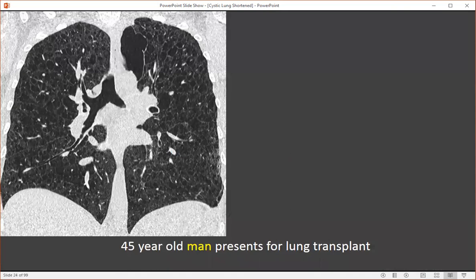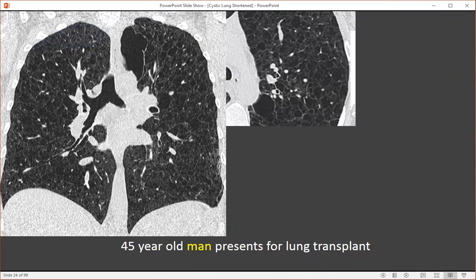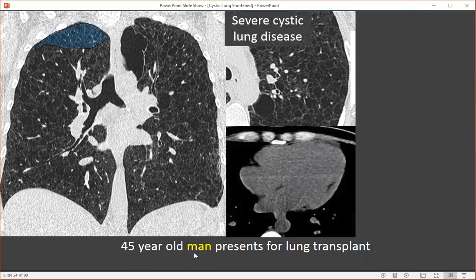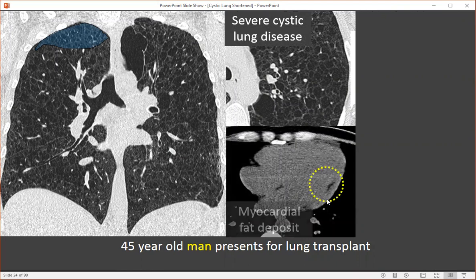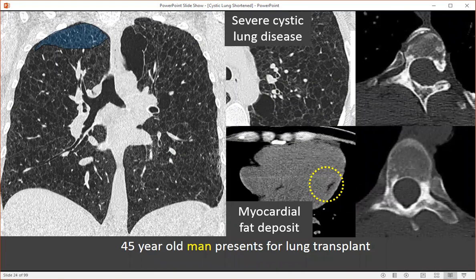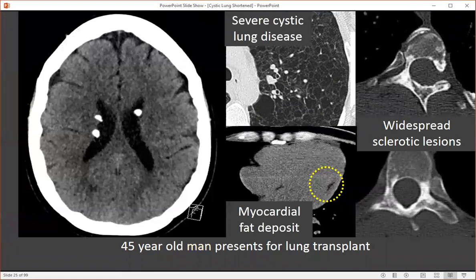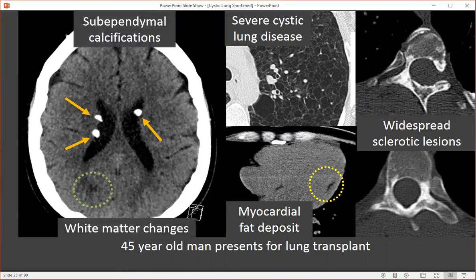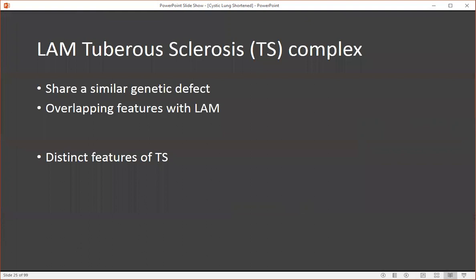This is a 45-year-old man who presented for lung transplant, and on his CT we can see severe cystic lung disease with several cystic spaces and thin walls. The lung apices are relatively spared, so this is probably not centrilobular emphysema. This resembles lymphangiomyomatosis; however, this is a man, and so that doesn't fit. However, this person does have myocardial fatty deposits, as well as areas of several sclerotic lesions throughout his bones, predominantly his spine. The key feature was subependymal calcifications on head CT with subcortical white matter changes — characteristic of tuberous sclerosis LAM complex.